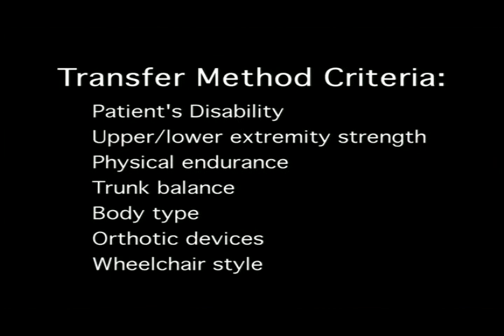The technique used for each patient is determined based on the following criteria: the patient's disability, upper and lower extremity strength, physical endurance, trunk balance, body type, orthotic devices, and wheelchair style.